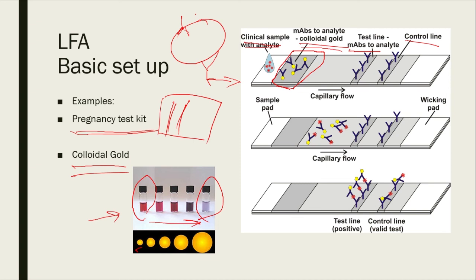So the lateral flow assay, the flow is the idea. Once you apply the sample there, through capillary action it will migrate in one direction.